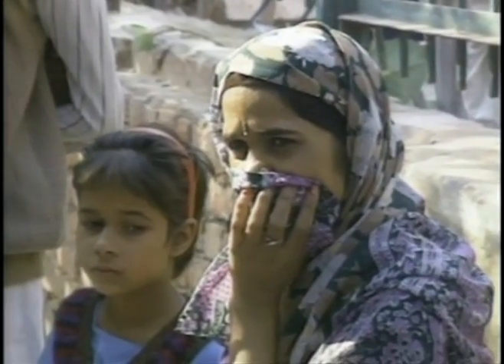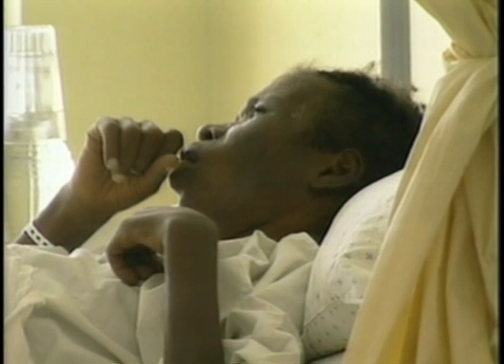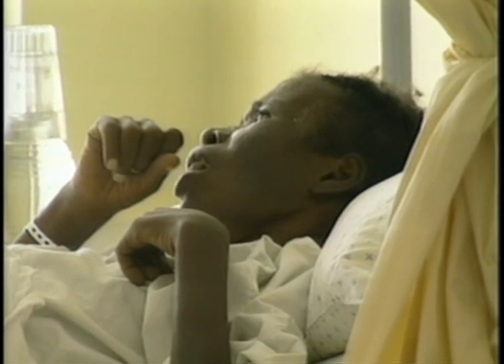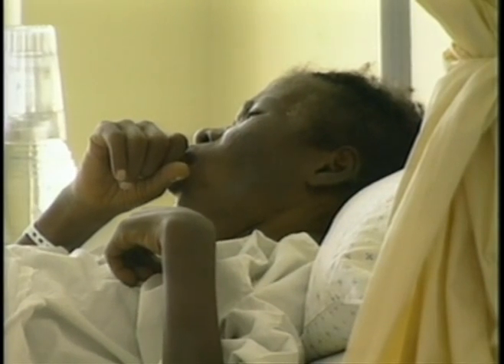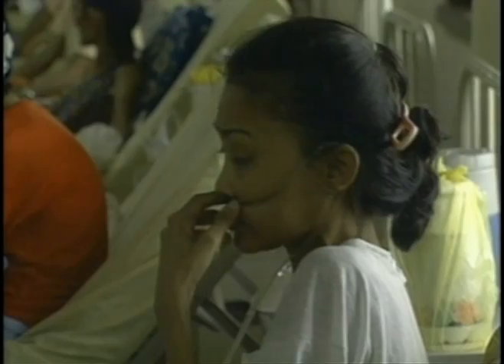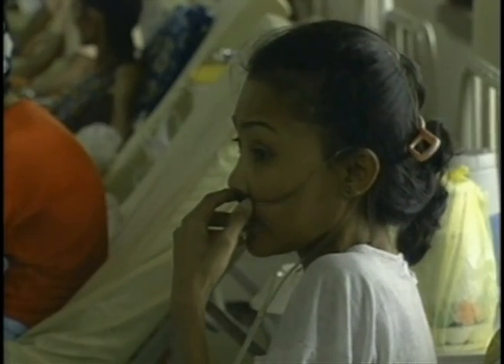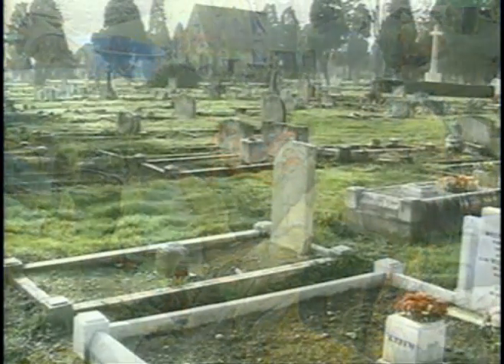If, on the other hand, a false negative result is reported, a catastrophic set of events can occur. A patient with TB is not treated. If the sample was a follow-up specimen, the intensive phase of therapy would not be extended, causing inadequate treatment. This can lead to additional suffering, spread of TB to family and community, and even end in patient death.